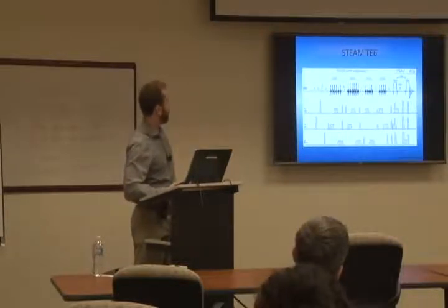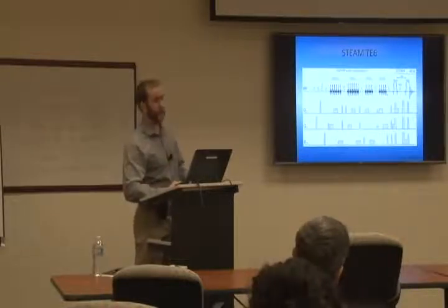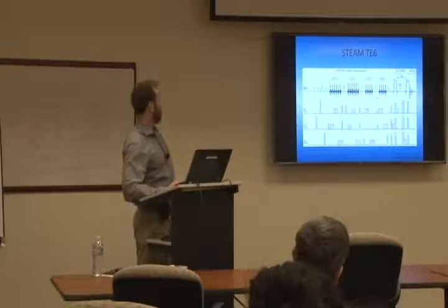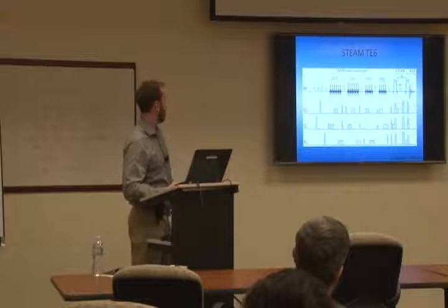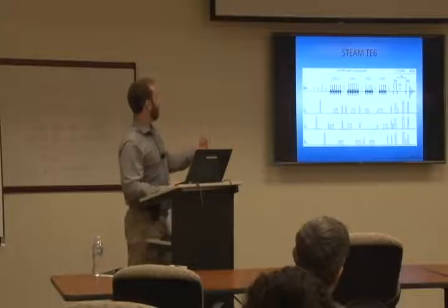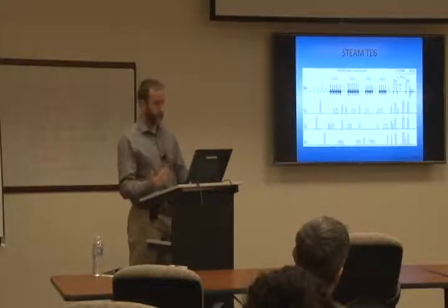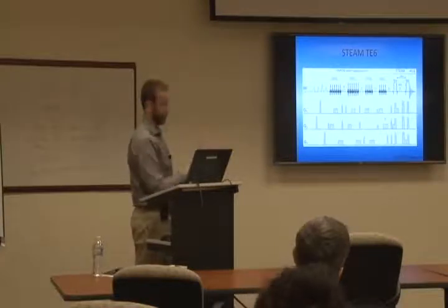The basic STEAM sequence has 3 water suppression pulses. This one has 8, and you can actually optimize all of them individually. It has outer volume suppression to clean up your spectra, which the basic sequence doesn't have. And it has this additional water suppression pulse. So just to show you how much more superior some of these sequences can be. And like I said, this one was very easy to get.